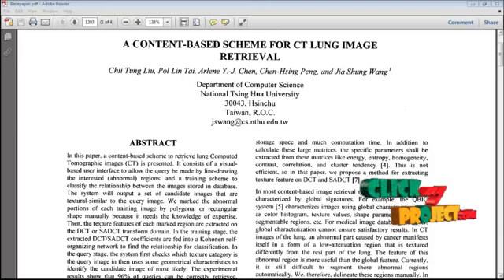The main steps in k-means algorithm are: firstly, we need to select an initial partition with k clusters. Step 2. Generate a new partition by assigning each pattern to its closest cluster center. Step 3. Compute new cluster centers. Repeat steps 2 and 3 until cluster membership stabilizes.